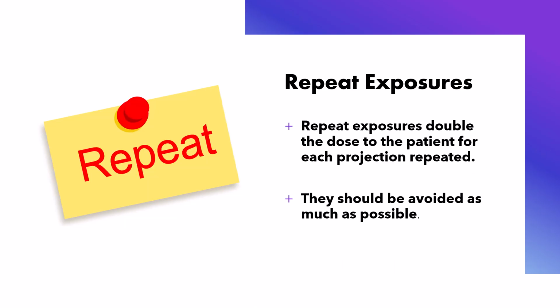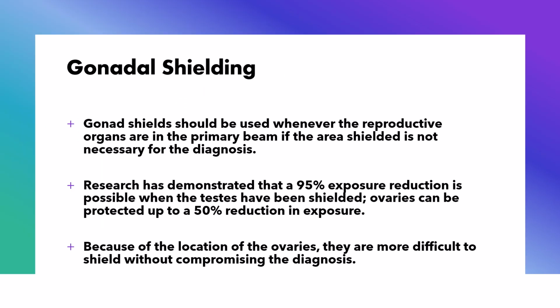Repeat exposures, if you do everything right to start with, you will reduce your repeat exposures. We are going to ask you to keep a log of your repeat exposures also. Gonadal shielding, like I said, this has become a little bit controversial. At Memorial Hermann, we are no longer using any shielding unless the patient requests it, and then we tell them that it's not recommended now because of studies. We have a pamphlet we can show them, but if they want it, we will still give it to them.